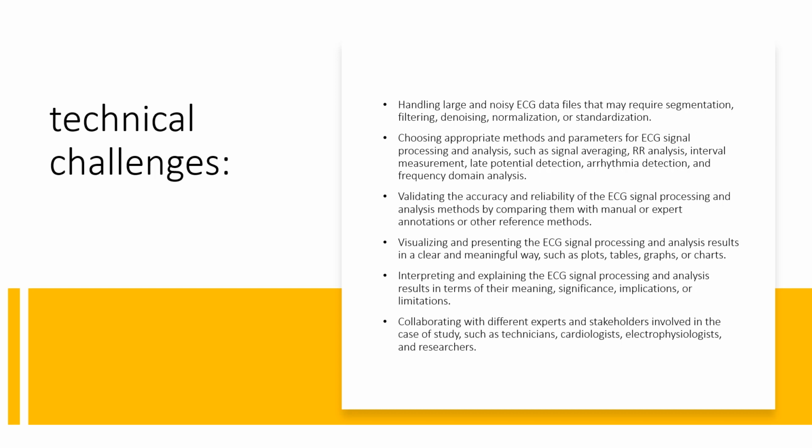Validating the accuracy and reliability of ECG signal processing and analysis methods by comparing them with manual or expert annotations or other reference methods. Visualizing and representing the ECG signal processing and analysis results in a clear and meaningful way, such as plots, tables, graphs, or charts.